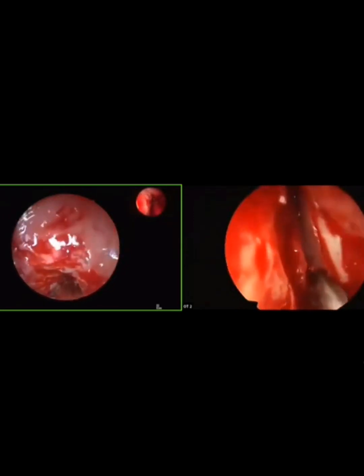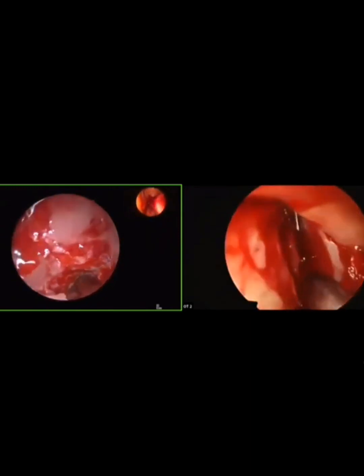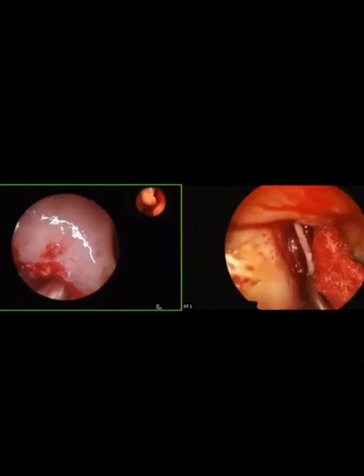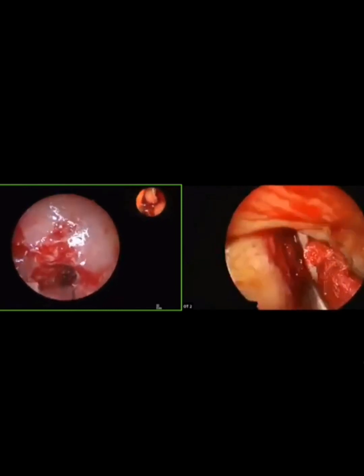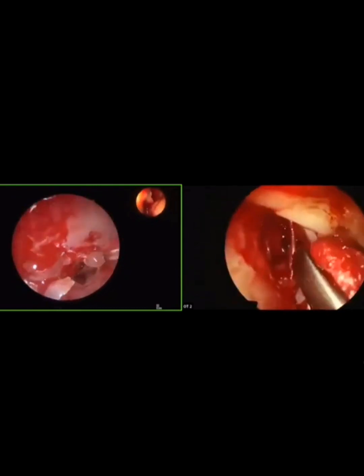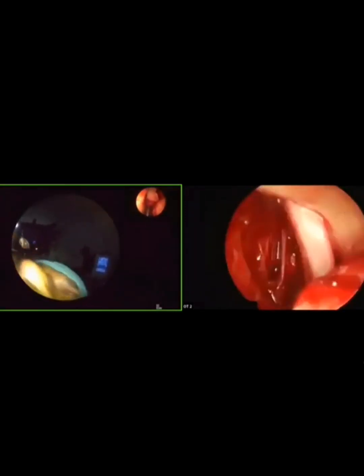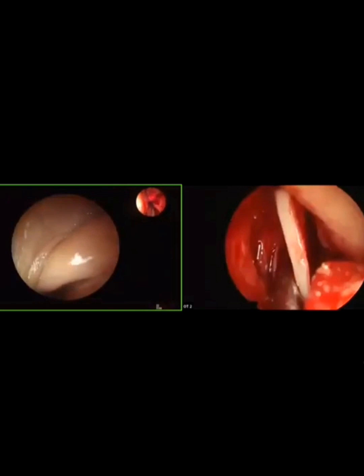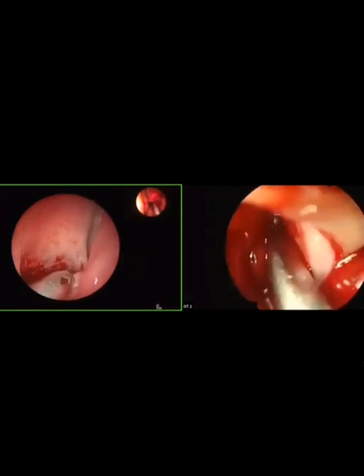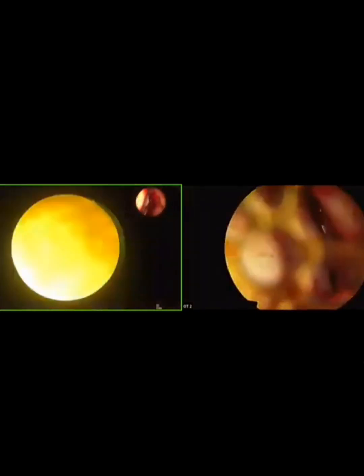The frontal sinus is very difficult in this patient. Let me see how I can proceed. First, clear the axilla. Merocel, upward forceps, Merocel. You have to keep Merocel for a while to stop the bleeding and then examine again. Don't be in a hurry. In case of bleeding, don't be in a hurry.